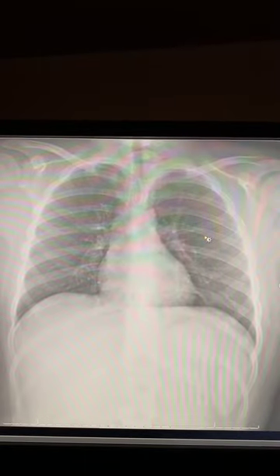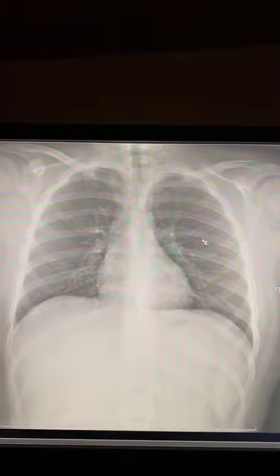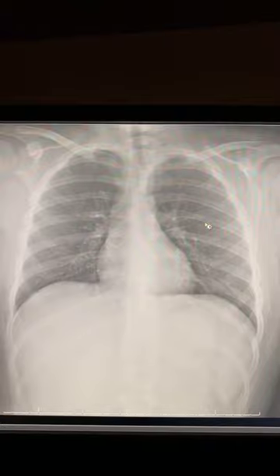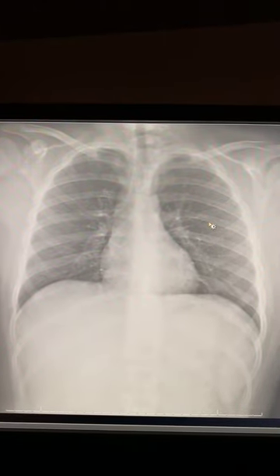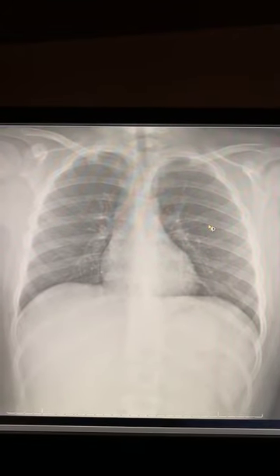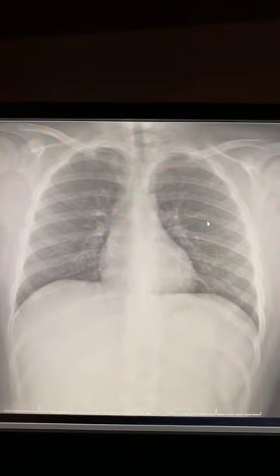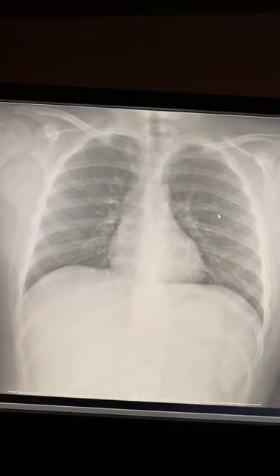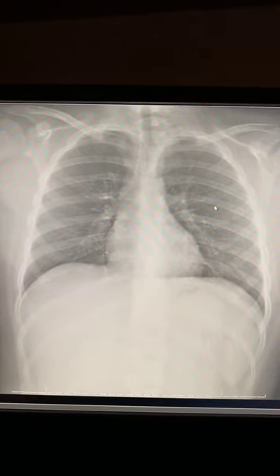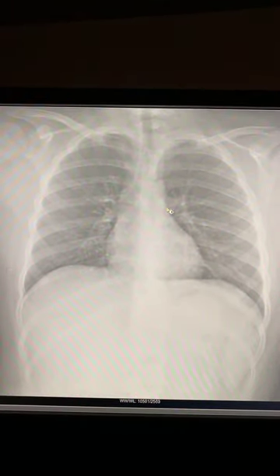My spiel, real quick, for people who haven't seen my live sessions before: please, please, please, describe everything before you jump to a diagnosis. I know some people may be tired of me saying this now, but describe absolutely everything before you jump to a diagnosis. Oftentimes your gut reaction is right, but oftentimes you will get confused and it will be wrong, or it will put you in a little box and you can only think about that one thing that your mind jumped to and you will not think outside of that box. So describe everything before, all right?